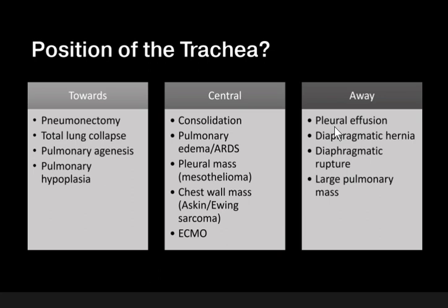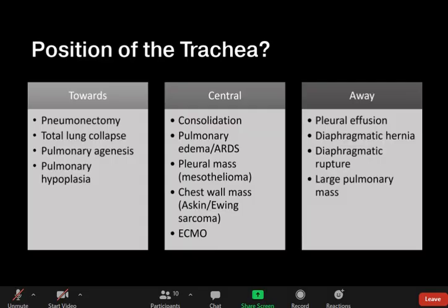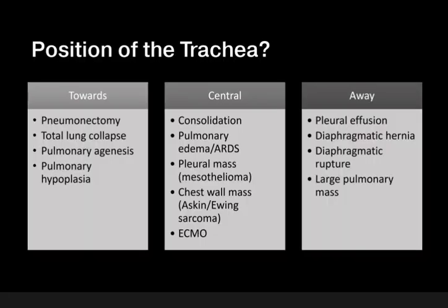I gave Benjo the journals. It's how to read critically ill patients' chest x-ray, three journals. They cover pulmonary edema, pneumonia, and thoracic devices. We should be keener on positioning, and know when to alert the clinicians about malpositioned tubes.